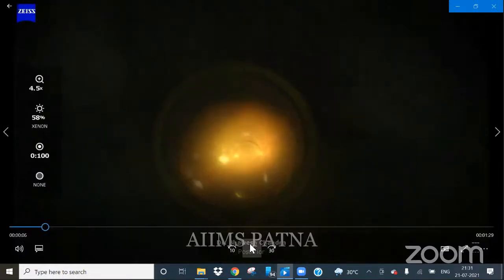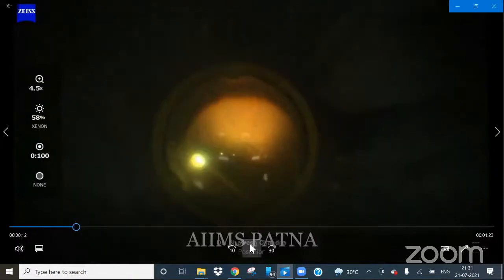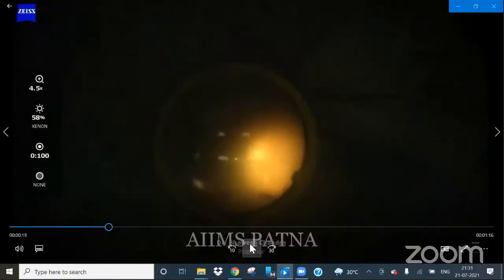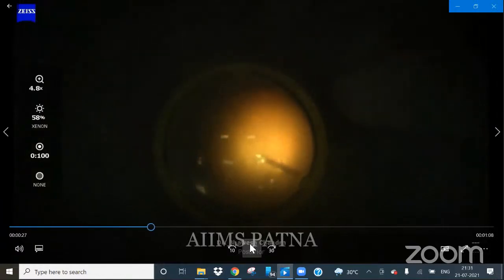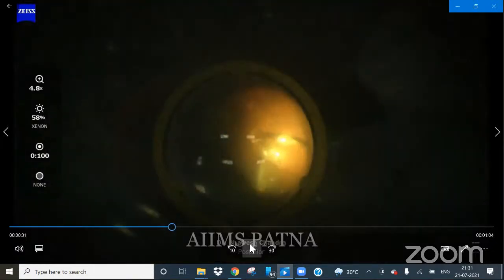So this is a video of dropped IOL. A foldable IOL has dropped in the vitreous, and it is resting upon the retina. So I am doing a good thorough central core vitrectomy and anterior vitrectomy, and freeing all the adhesions around the IOL. After achieving a complete thorough vitrectomy, now I am grasping the end of the haptic with the tooth forceps and bringing it up at the pupillary plane.